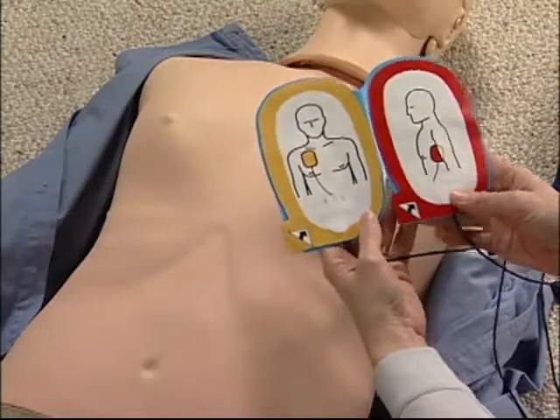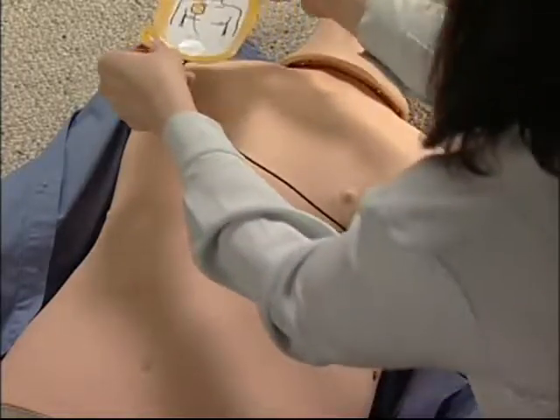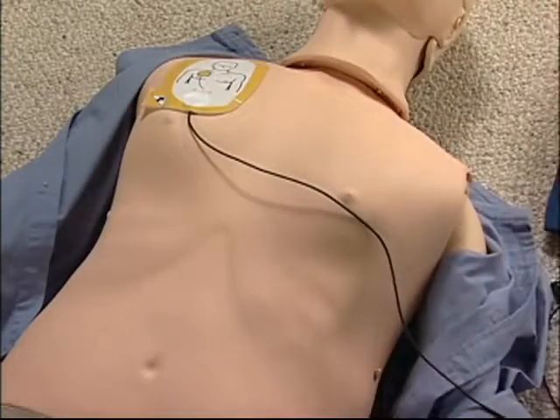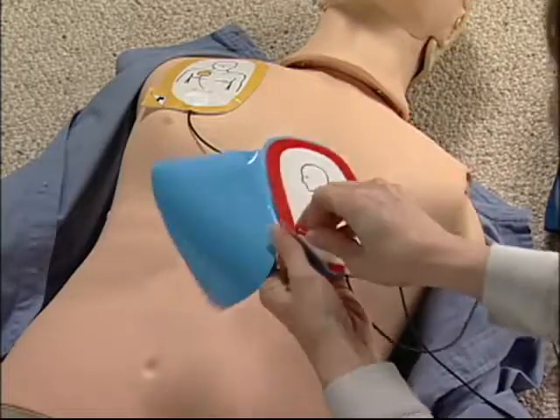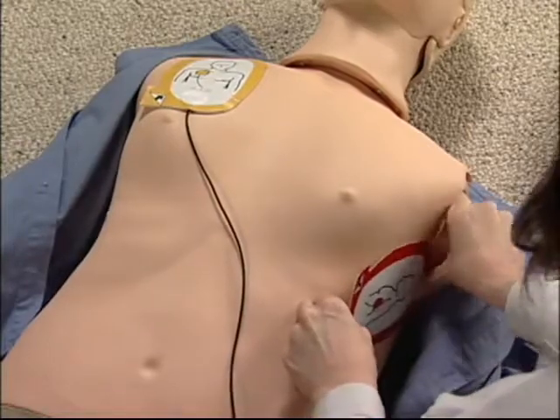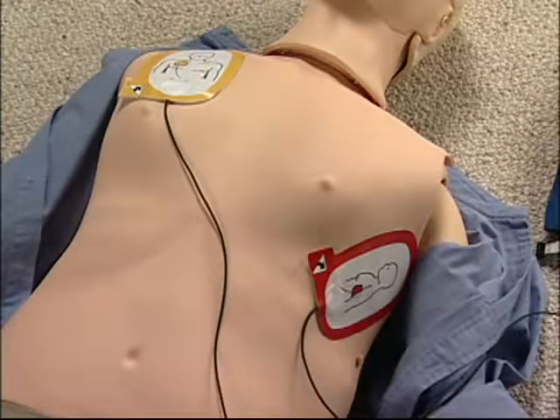Peel one pad off blue plastic. Apply pad to bare skin, exactly as shown in the picture. This pad goes here, just like in the picture. Press pad firmly. Peel other pad off blue plastic. Apply pad to bare skin, exactly as shown in the picture. The other pad goes here, under the arm, again, just like in the picture. Press pad firmly. It doesn't matter which pad you stick on first.